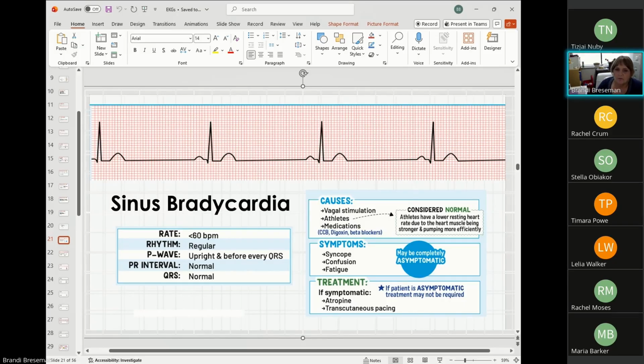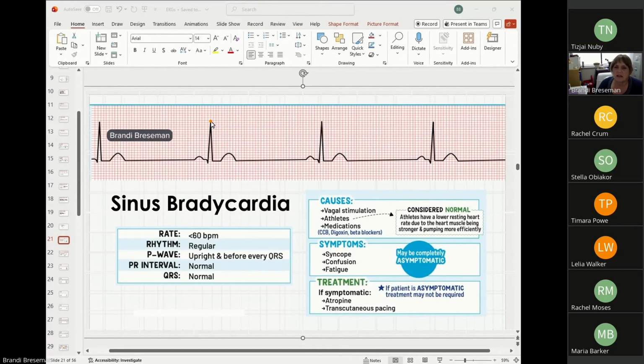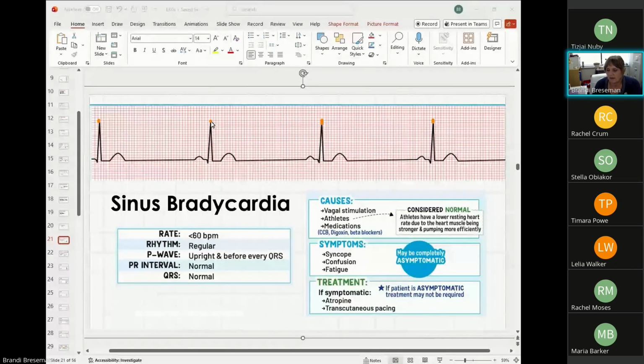So you will set it to pacing or sync mode, and then it will sync itself. When these little things come across your screen, there will be a little dot, a white light at the end of it. And so once you see that you have this white light every time a QRS comes up, that tells me that my machine has synced to my patient's rhythm. And then I am going to get ready to do pacing.